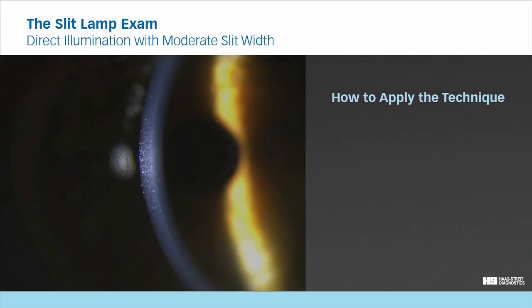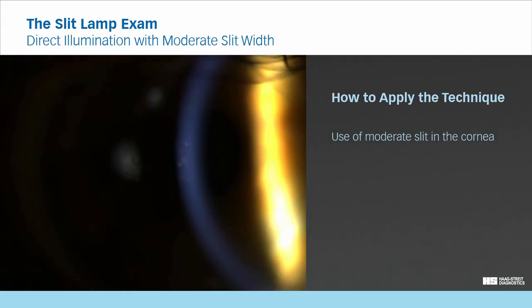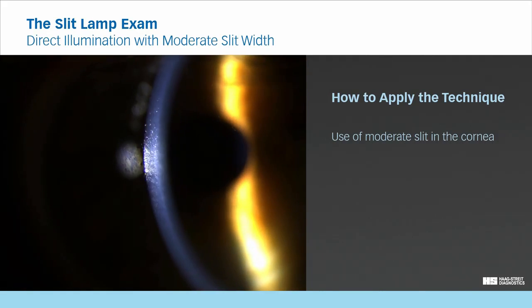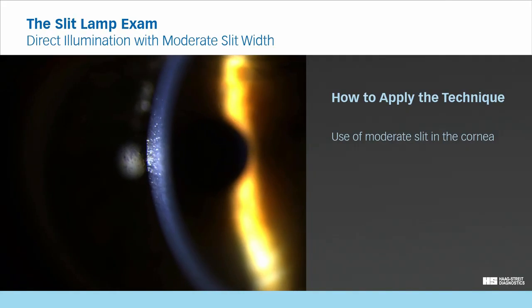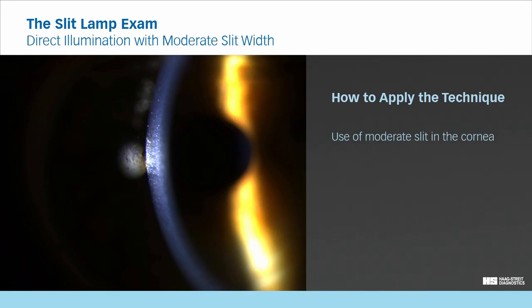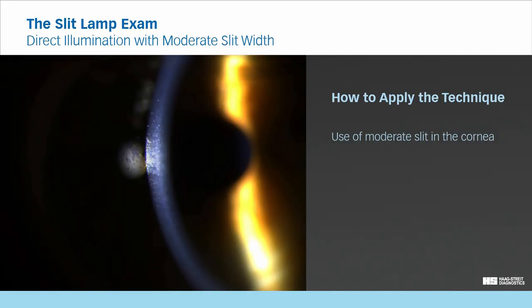How to apply the technique. In the beginning, it can be challenging to obtain a focused image of the cornea. A simple way of getting the cornea into focus is as follows. Move the slit lamp towards the patient's eye until you see a light band on the cornea. Concentrate on the tear film. You will find small particles that move in the interblink interval. Once you see these particles, your focus is on the corneal surface. Note that the iris is out of focus because it is further beyond the plane of the cornea where the slit lamp beam is focused.